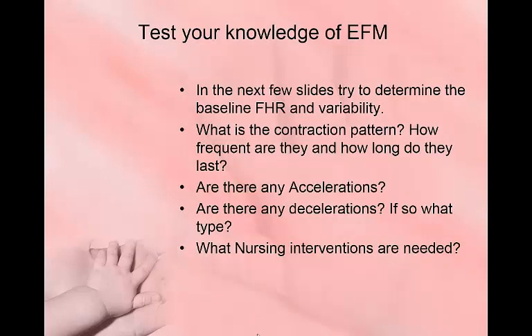So the next couple of tracings, and we're going to do this in the classroom, we'll go over this and discuss this, but you guys can look at these in the meantime, is look at these next couple of slides of the fetal heart rate tracings. Try to determine the baseline fetal heart rate and variability. So take a look at these on your own. Look at the contraction pattern. You know, how often are the contractions coming?